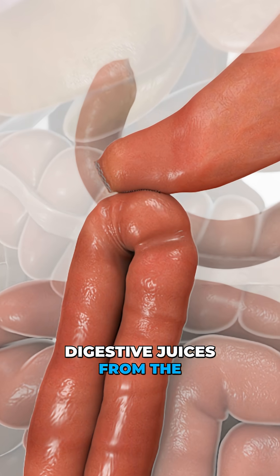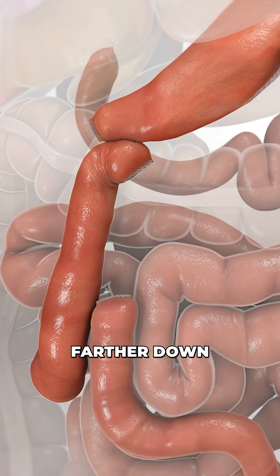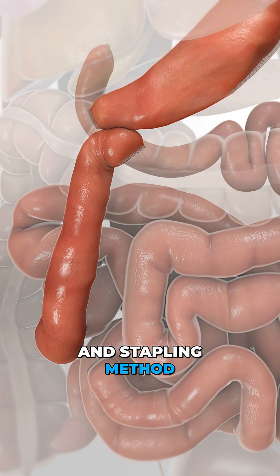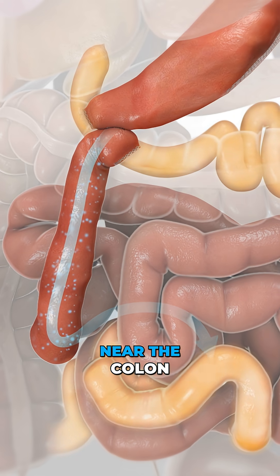Next, the limb that carries digestive juices from the bile and pancreatic ducts is cut and moved farther down the small intestine. Using the same opening and stapling method, it's reattached so digestive juices finally meet the food stream near the colon.